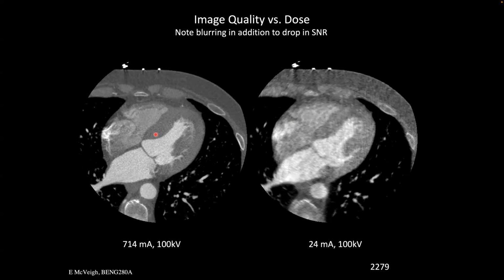But one of the reasons why there's so many of these scanners is that, let's say the median billing for a CT scan is $450. You do one of these every 5 minutes in the United States. In Beijing, they do one every 2 minutes. They just like boom, boom, boom. They put so many people through these scanners. It's incredible, right? And so here, to make up your $1.5 million doesn't take very long, right?